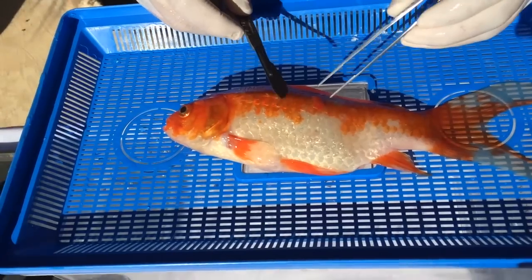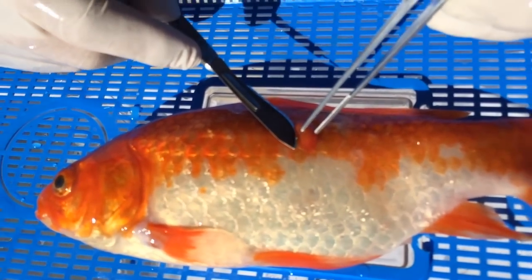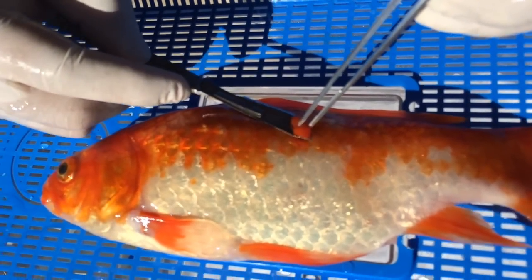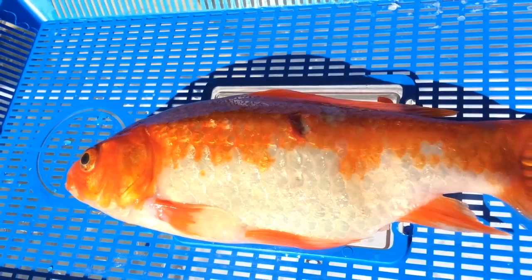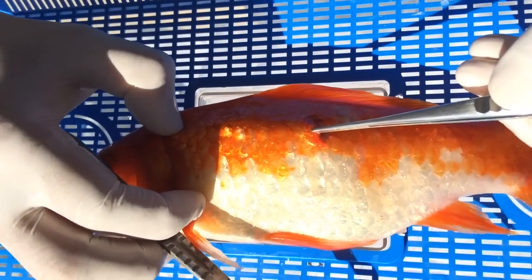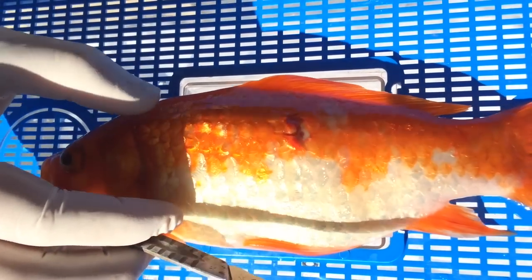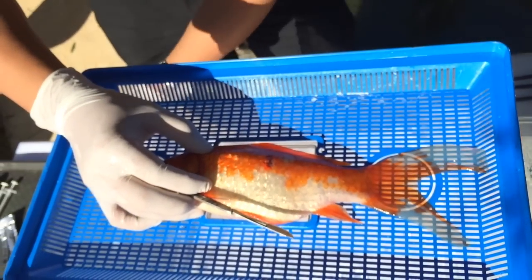Great, so to start off with the procedure — here is the lump. We're just going to cut along it. Hold your scalpel blade flat to the body to try and get as much off as possible. You can see it's actually gone under the scale, so what we're going to do is pick out some of these scales.